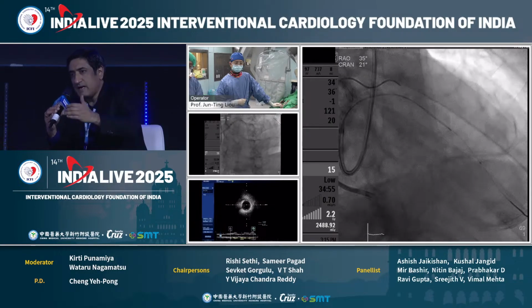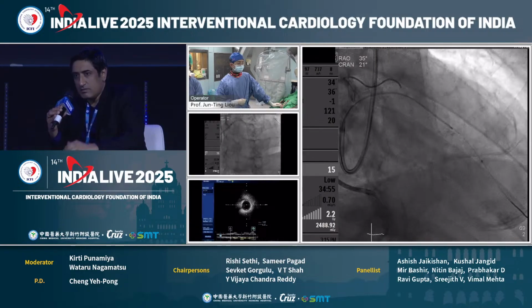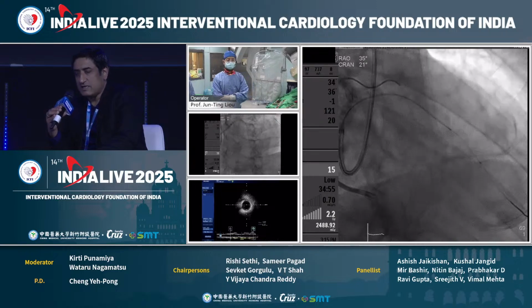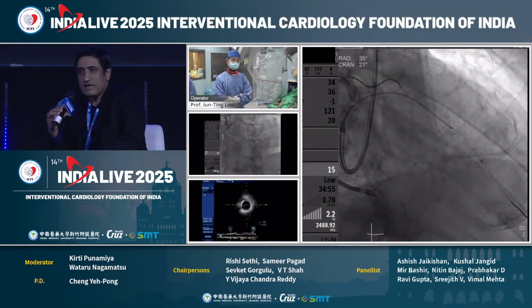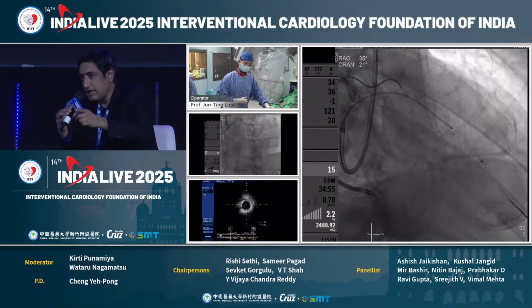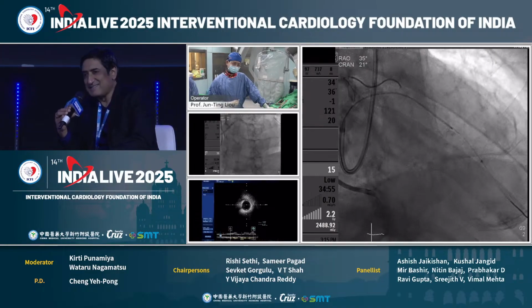So the parallel wire technique may be used at a relatively earlier stage. In this case you are lucky, because you are already in a very big branch. Yes, I believe it's in a branch. I'm very lucky. But it's extraordinary.